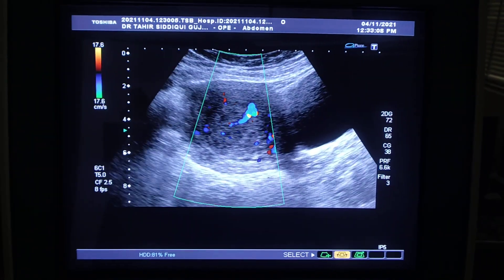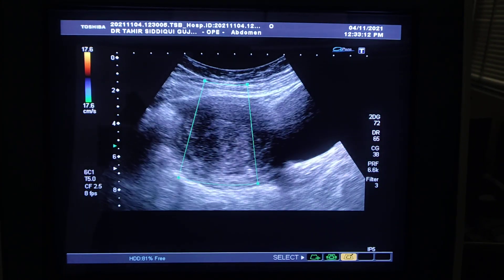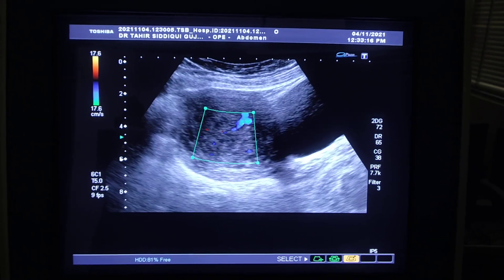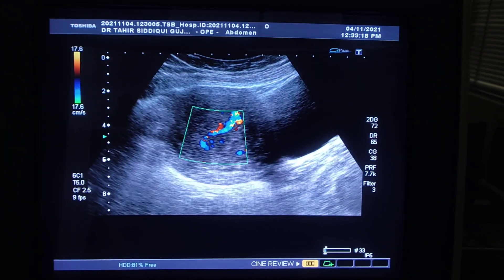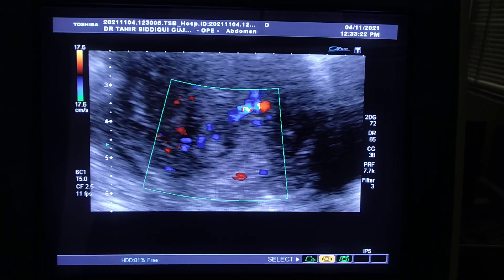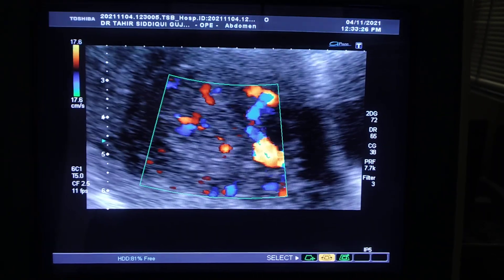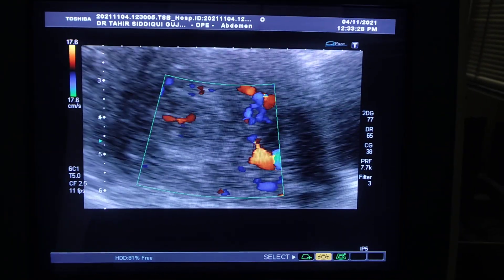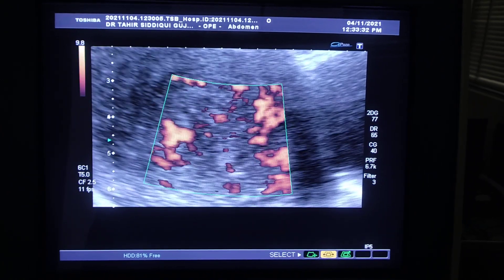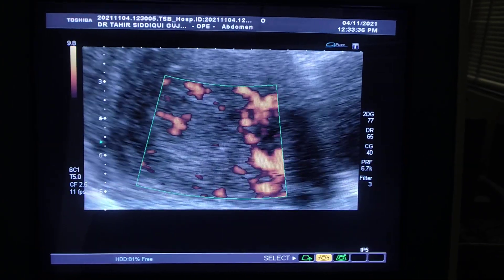It shows significant vascularity as well. I have placed the color Doppler to show you the degree of vascularity of this mass, which is the fibroid. It is highly, highly echogenic.